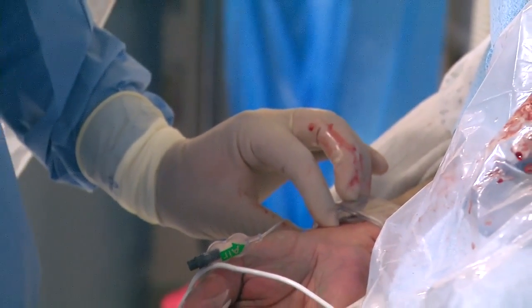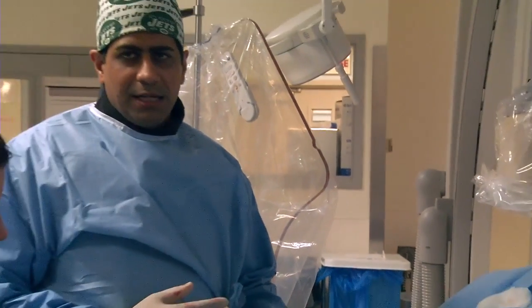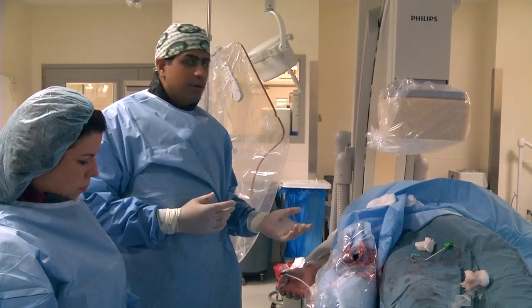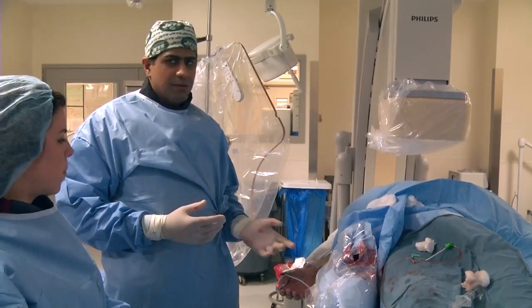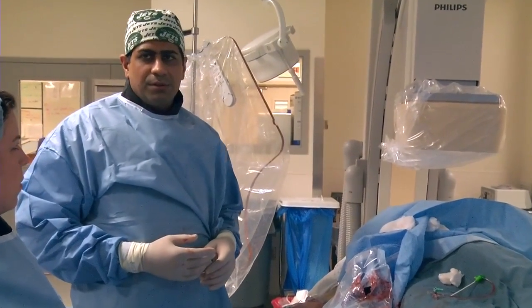The big advantage to the patient right now is he doesn't have to worry about lying down flat. He could immediately ambulate depending on his sedation level, and it's a much more comfortable procedure for the patient, as well as all the benefits that we talked about before, such as reduction in vascular access site complications. So that concludes our procedure.